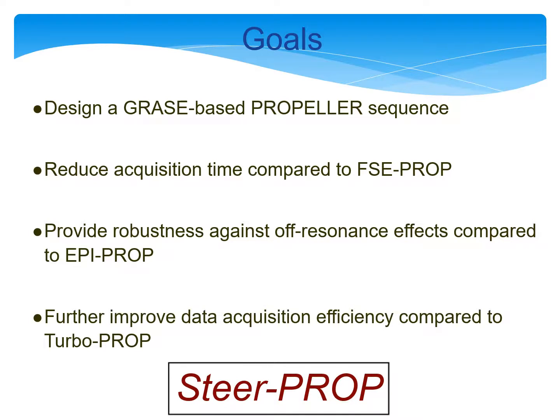The specific goals of our work were to design an alternative GRASE-based propeller sequence that reduced acquisition times compared to FSE propeller, provided robustness against off-resonance effects compared to EPI propeller, and further improved the data acquisition efficiency compared to turboprop. And this is what we created as SteerProp.